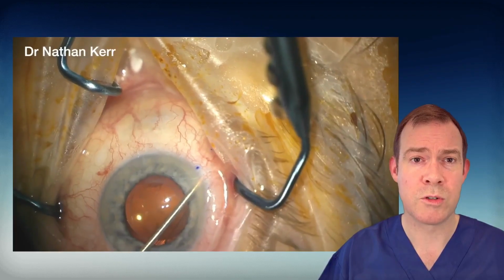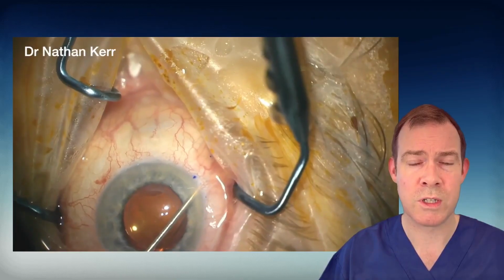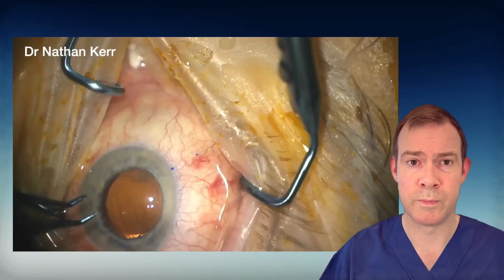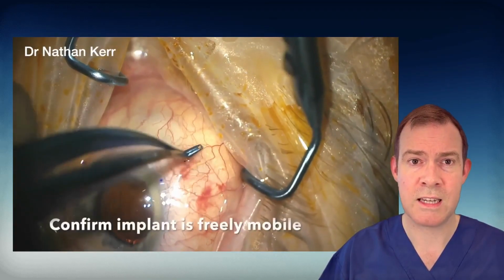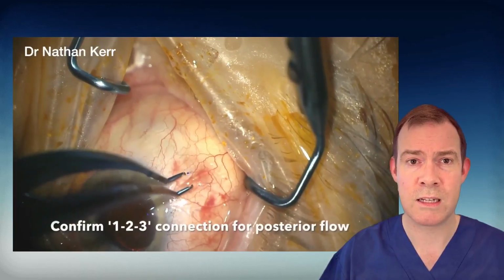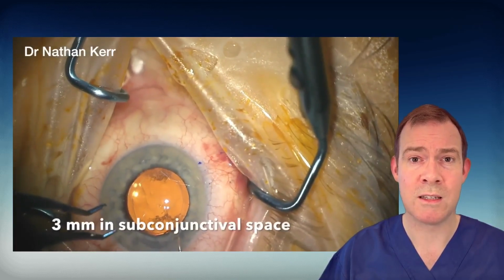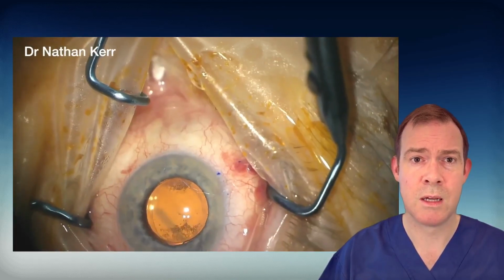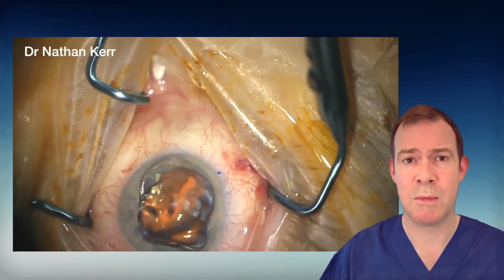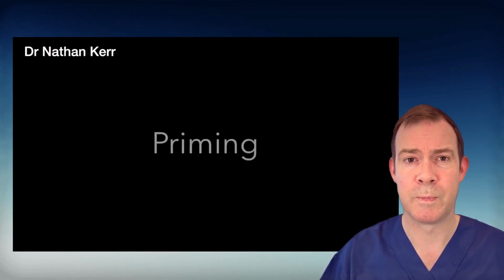Once the slider is almost fully advanced, release your second instrument and control any forces so there's no lateral flick as the injector is withdrawn. Now inspecting the XEN, we want to ensure that it is freely mobile and straight, and we can adjust it quite easily at this step to ensure that there's 3 millimeters in the subconjunctival space, leaving 2 millimeters in the sclera and 1 millimeter in the anterior chamber, and this can be visualized with a gonioscopic prism.